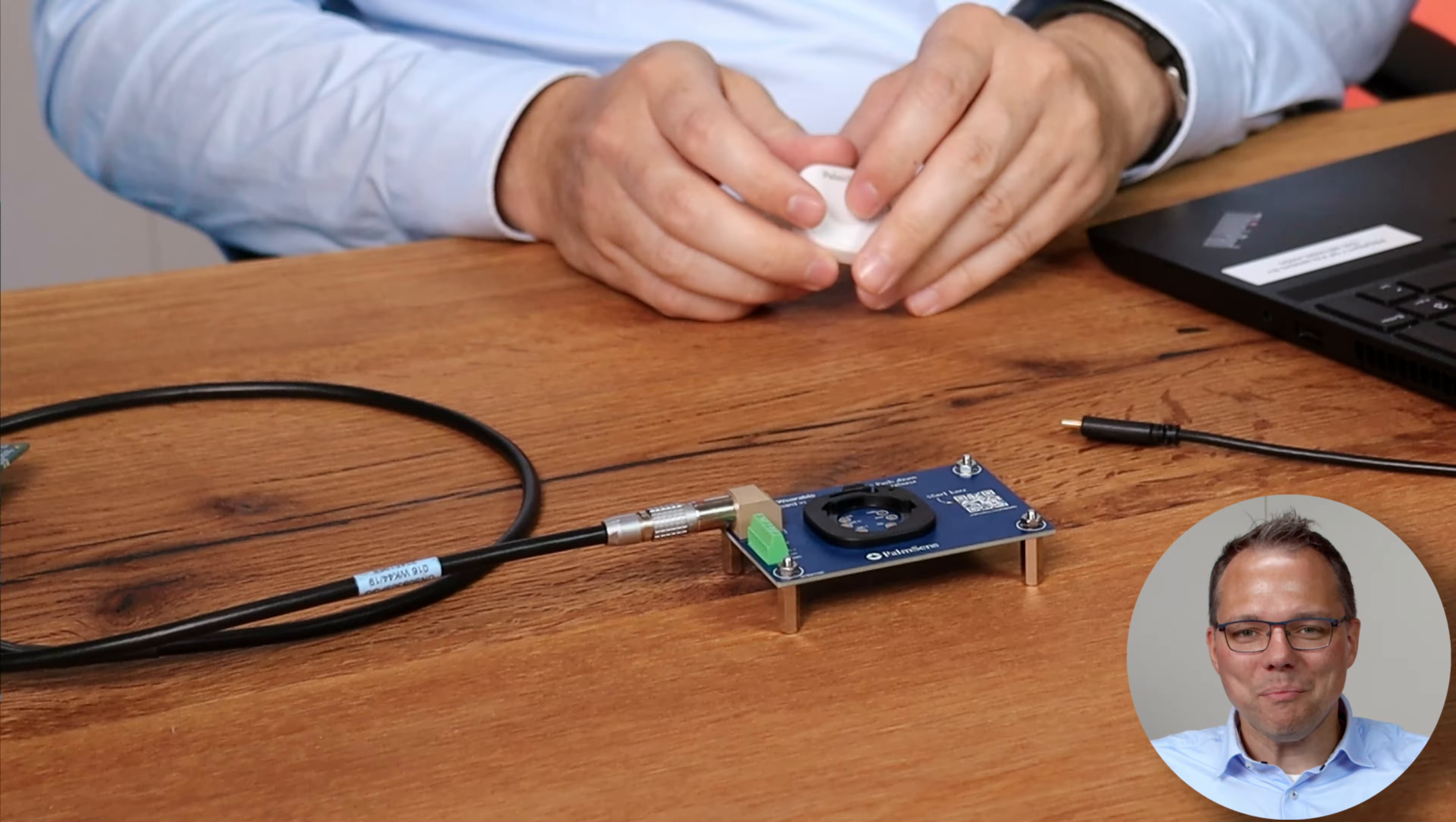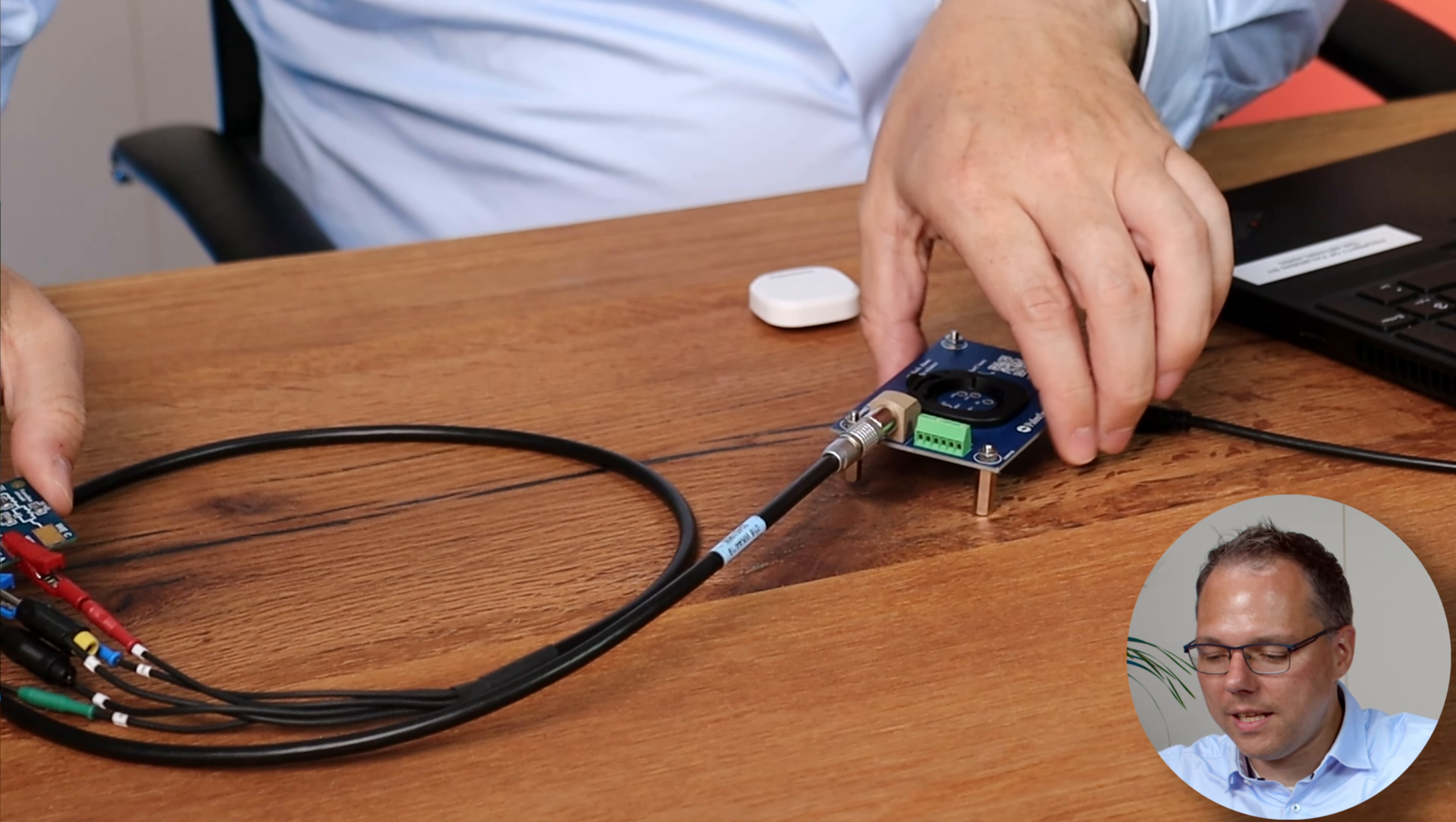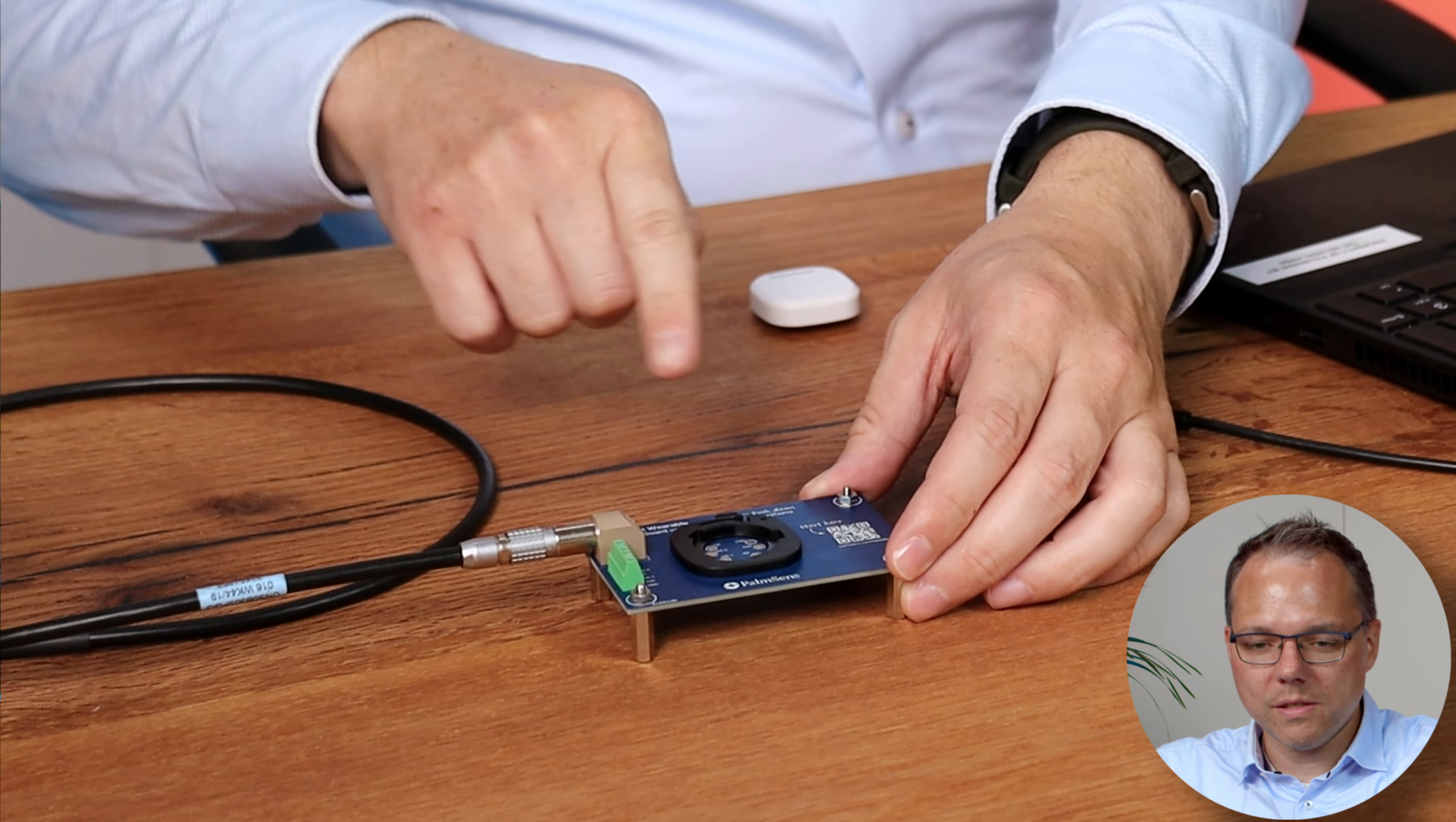For this purpose I've already prepared a test setup. I've just used here our dummy cell. I connected the working electrode to a 10 kilo ohm resistor on the dummy cell. The cable is connected to this breakout board.